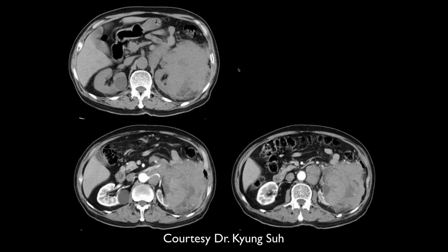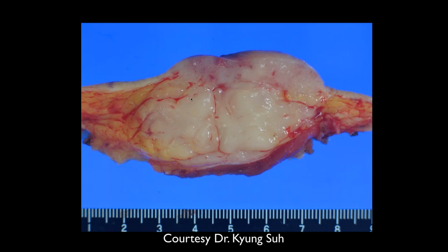Okay, well, here we are with sort of this diffuse invasion of the left kidney. Now, looking at this and the other lesion, the way that this sort of effaces but isn't really compressing much, this is more of a behavior of a lymphoma type lesion. And that was a skin lesion. Oh, okay. So, lymphoma.